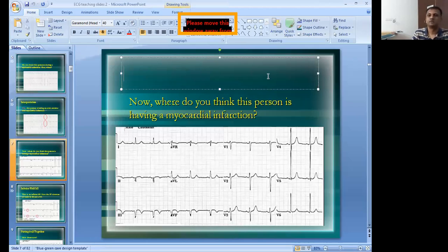The reason I keep on stressing these things is that the basics are the main thing. ECG, most people think it's difficult. Actually, it's easy because you need to spend more time when you're learning at this basic level. Some people try to jump to a conclusion straight away, they want to get the diagnosis. That's not the way you read ECG. ECG is a schematic or structural way of interpreting. If you do it that way, you won't miss any subtle things or the major findings.